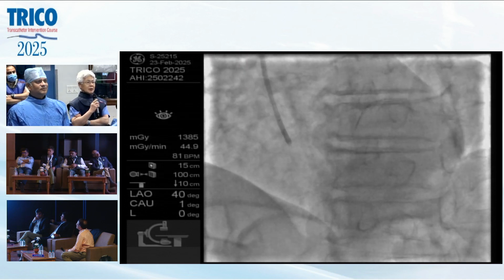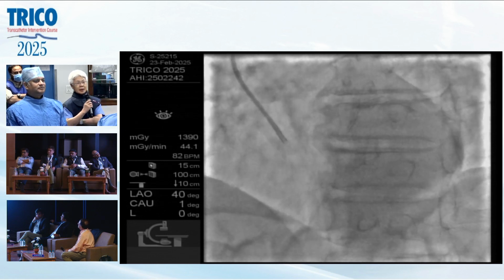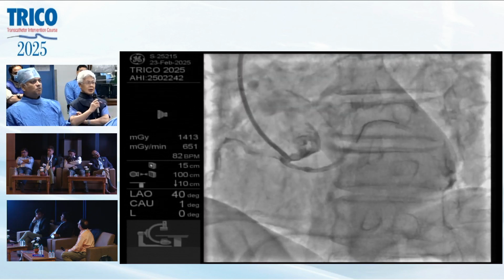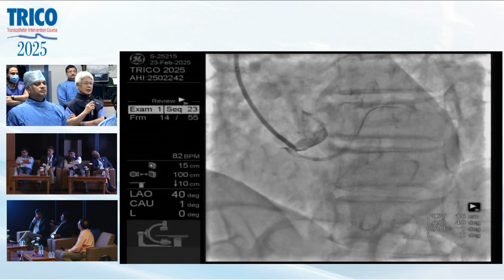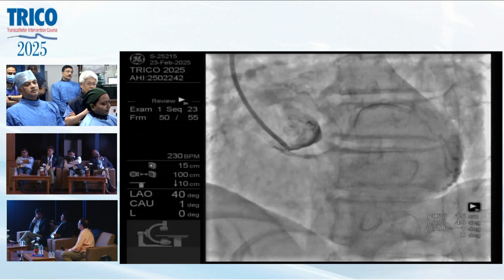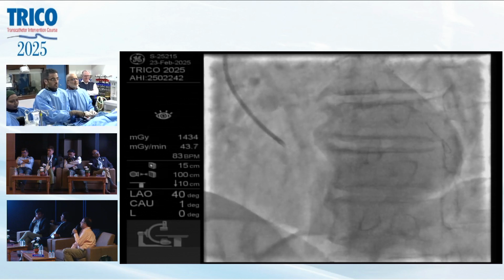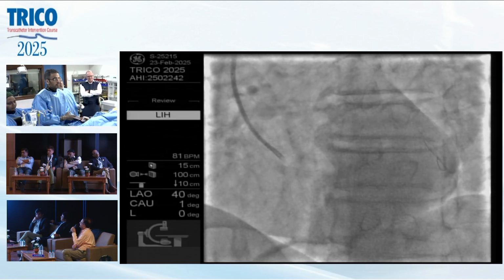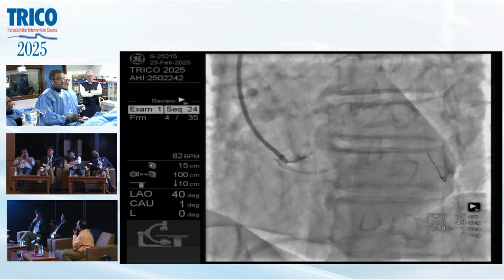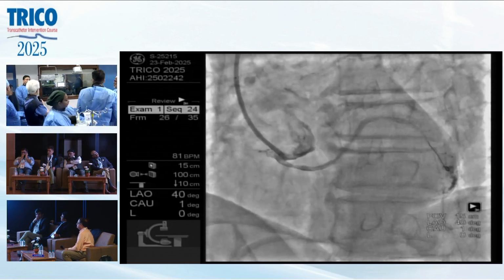If there is some anomalous vessel, then only we can do OCT, not otherwise. Here, I am not able to do OCT. I think I cannot cannulate it selectively. What do you think? Yeah, I think it's going to be tough without selectively going in to do OCT. And IVUS might not even go. We can try, but I'm afraid of the blood flush. What do you think? Not so good, right?